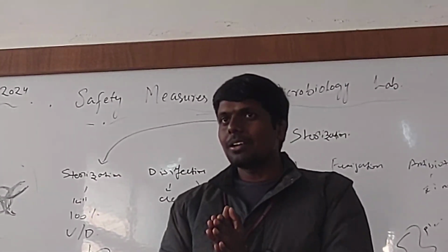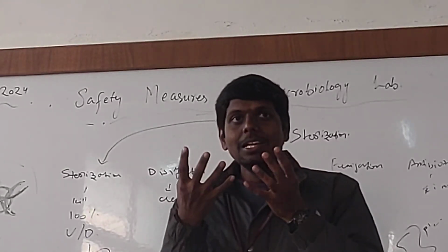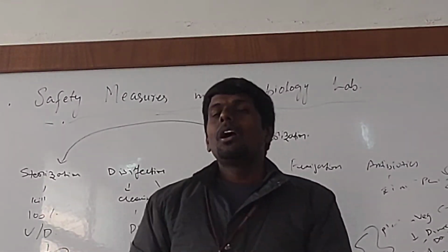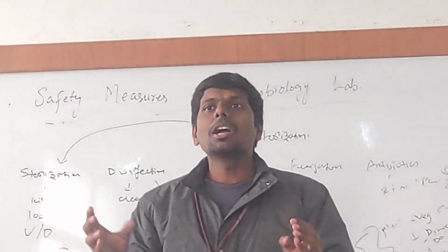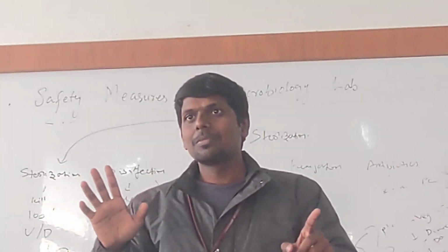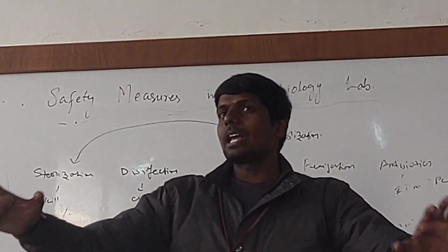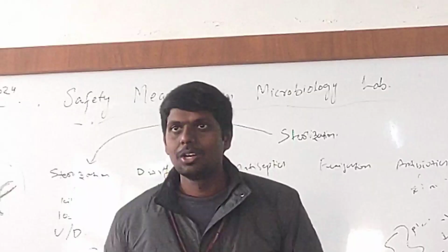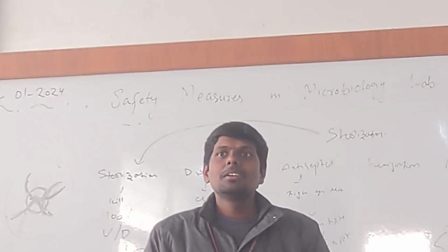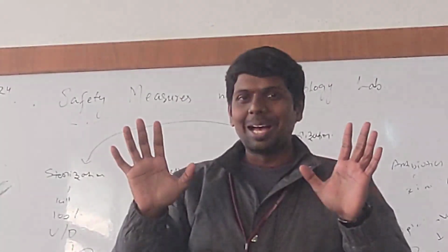Do you know how a nebulizer works? The children's nebulizer, yes, they get that fumes, right? Similarly, we will convert formaldehyde into fumes. Fog. We will convert that substance into a fog with some machinery, and that fog will be subjected to one particular area, and that process is called fumigation. Fog fumigation. Like diffusion? Okay, I got the answer.